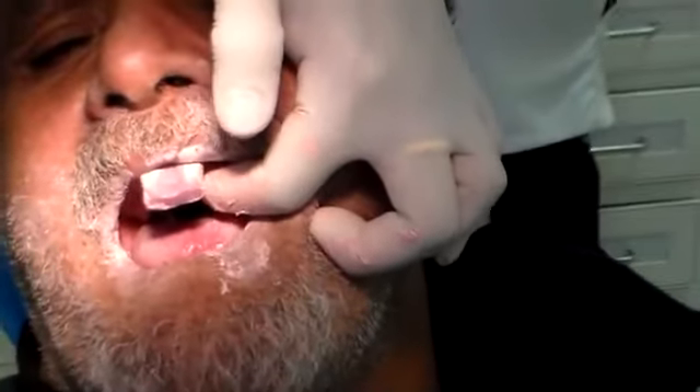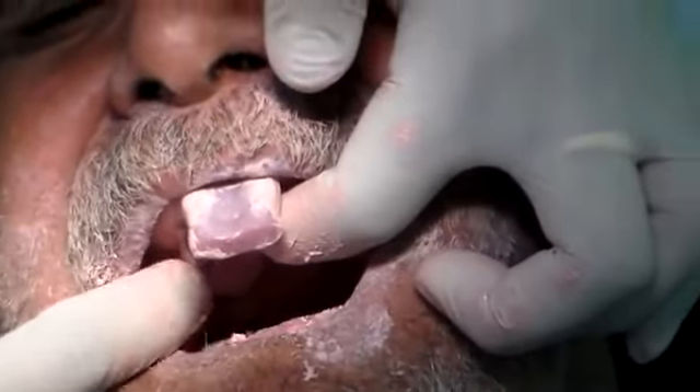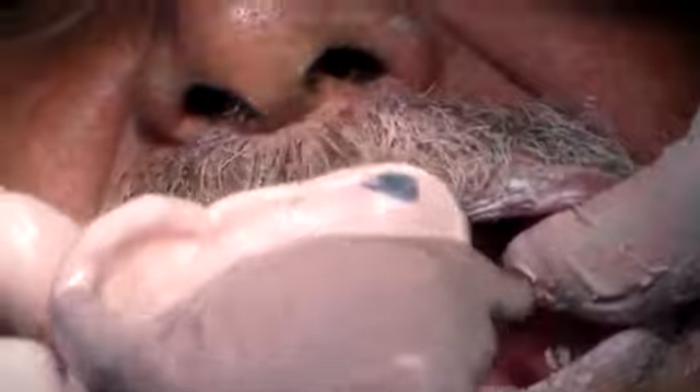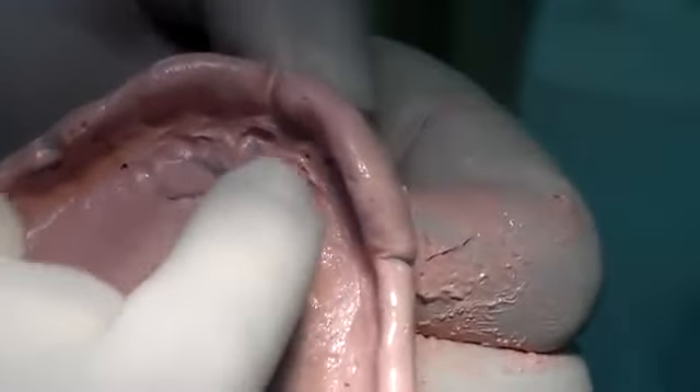So this is the easy way to know — from the old mix, you can check that. You can see all my borders. When I see the impression, I can see green areas along the border. This shows me that my impression is at the level of the green stick and not beyond it. If you have zinc oxide sticking up one to two millimeters above the green stick, you know that you have overextended your denture. You may have some denuded areas in the ruga area and the papilla area, meaning they have been compressed. Since this is a close-fit technique, obviously there will be some compression there.